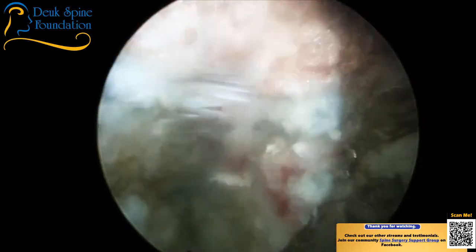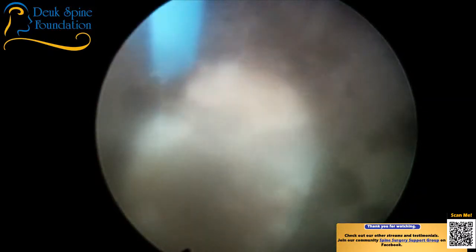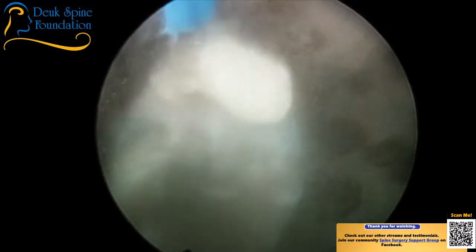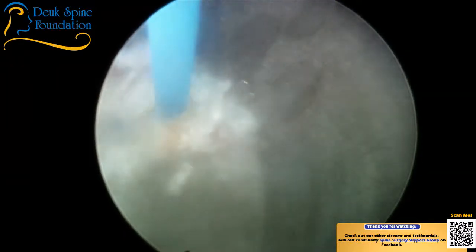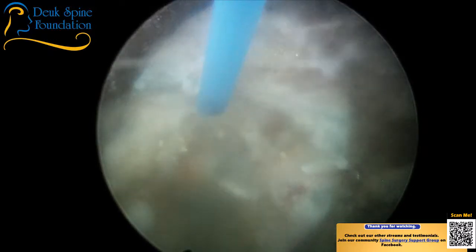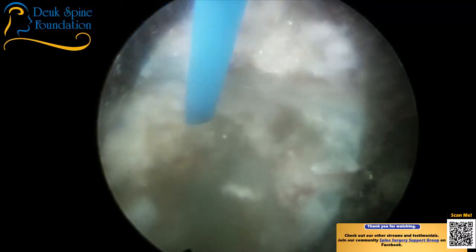Yes. Nervous. There's some fat right around the nerve in the epidural space. Remember, we're looking from the neuroforamen in. This is a view that 99.9% of spine surgeons never see in their entire career. Why? Because they don't know how to do this very advanced type surgery. This is called endoscopic transforaminal spine surgery. It's very hot, very new, and it's the future of spine surgery for all herniated discs.